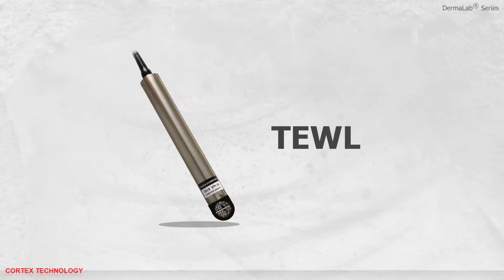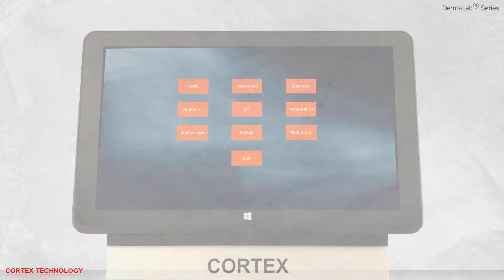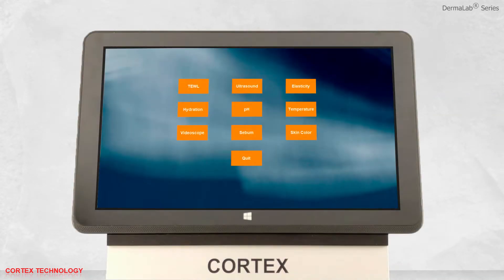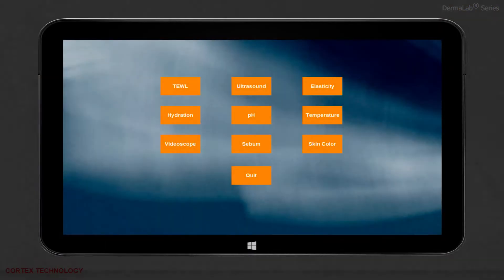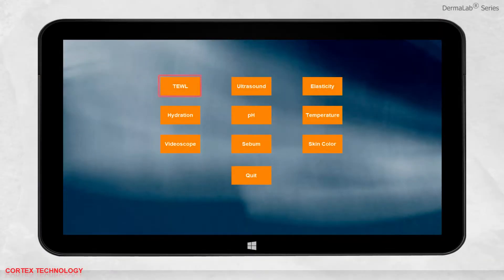Transepidermal Water Loss Application. Open the software. Select the application.